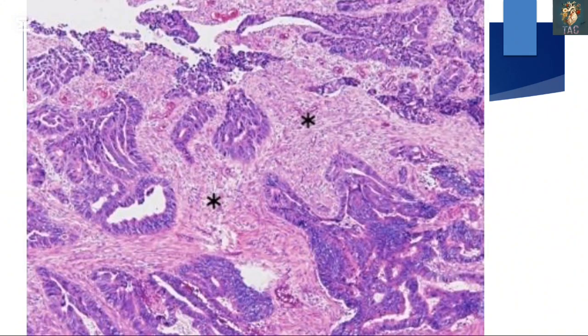This slide is of colorectal carcinoma, which presents as adenocarcinoma arising from dysplastic epithelium. On microscopy, we see malignant glandular structures. You can appreciate over here different sizes and shapes of glandular structures all over this image. The glands are angulated back to back, lacking the normal spacing seen in benign glands. The glands show hyperchromatic nuclei.